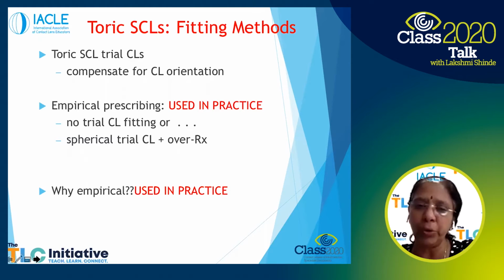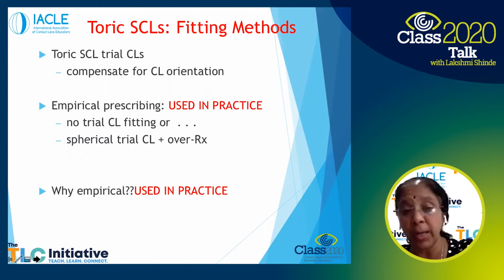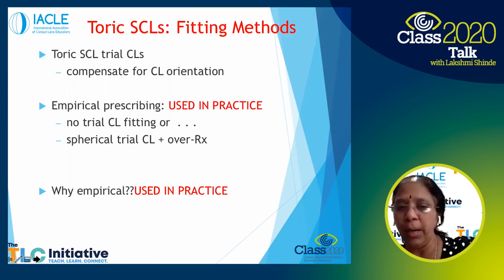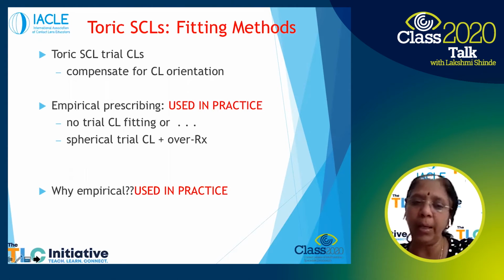So if somebody comes to you and you say, okay, why not try soft toric lenses? And if you have it within your stock, then it's easier to just give it to them and say, why don't you try it, and teach them how to fit and remove, and then ask them to come back and show you as a follow-up visit, when you assess how the lens is performing and so on and so forth, rather than giving them a trial and then saying, no, I need to check, and then you come back and then maybe I need to change the lens and all of that, which rarely happens, as I said, in terms of rotation.